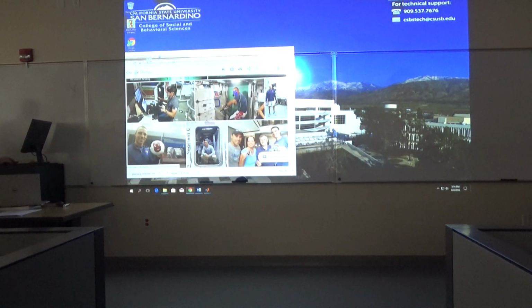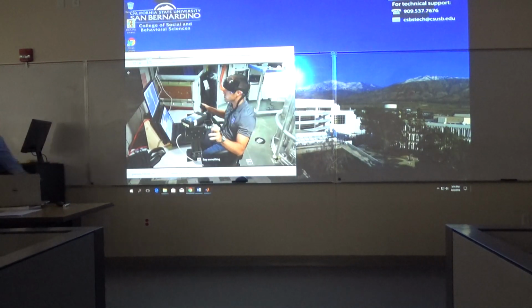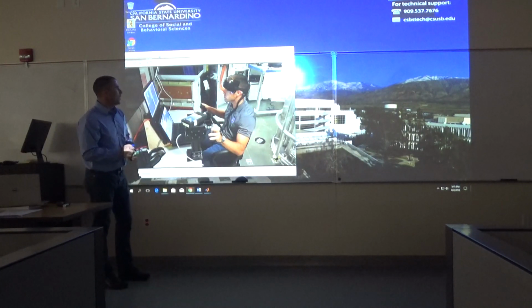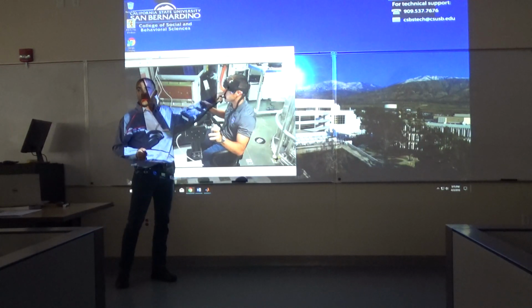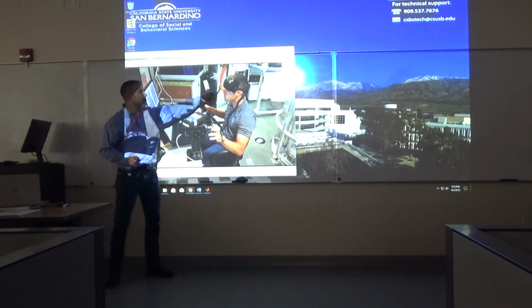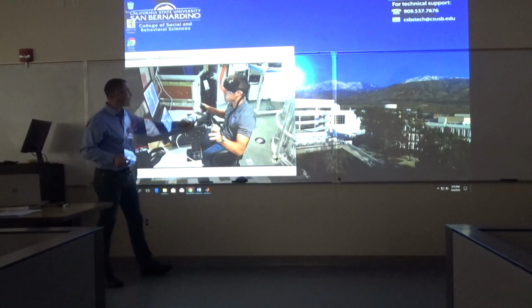Anyways, look, I was trying to see. Oh yeah, here's some more brain activity you can record. This is called functional near-infrared spectroscopy, and it's a way to measure blood flow in the brain, particularly the frontal cortex, and you have these EEG electrodes on the frontal sites as well. Now, it's interesting to measure this activity because of what we're doing here.